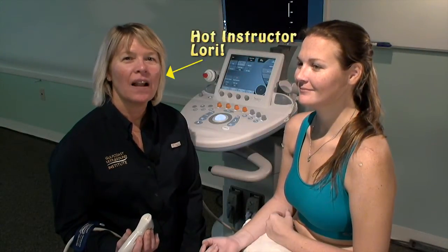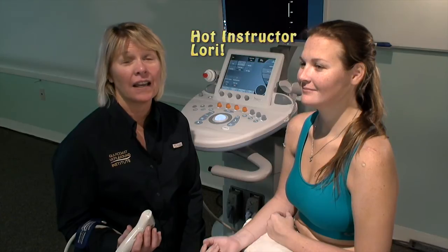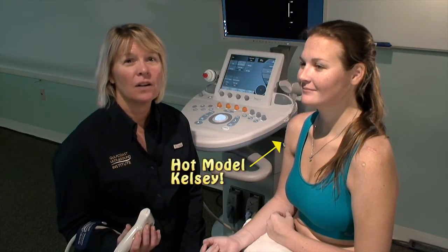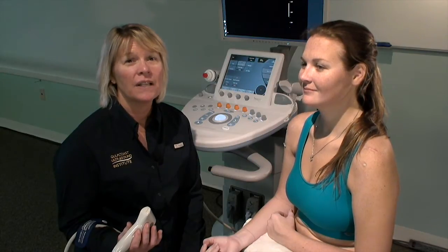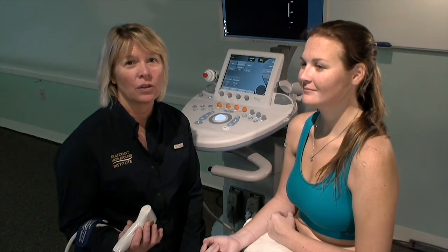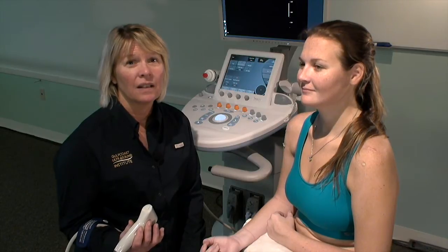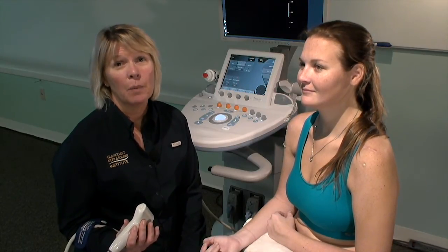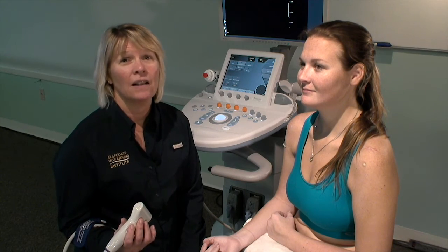Today's scanning tip is about how to identify and correct for the artifact anisotropy. Anisotropy is an artifact that occurs in musculoskeletal ultrasound imaging when the sound beam interacts with the structure at a non-perpendicular incidence. We see this most often in tendons and ligaments, but we also see it occasionally in nerves.